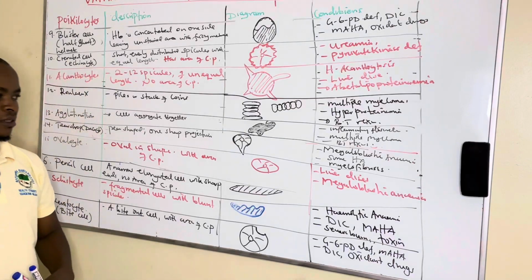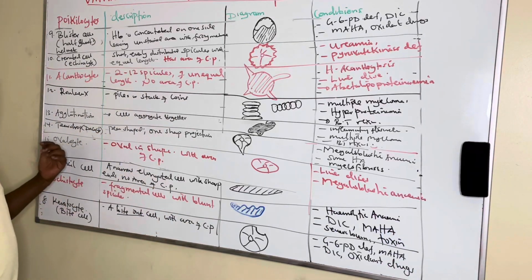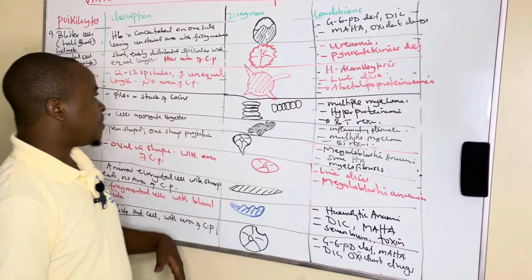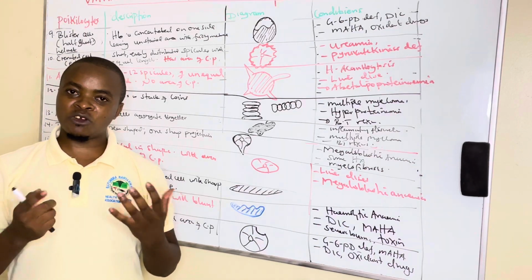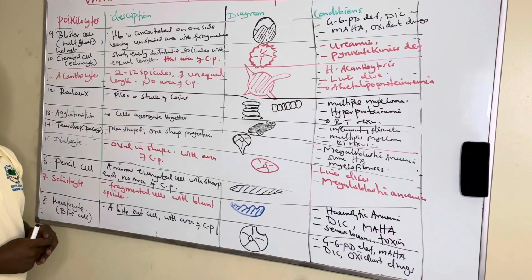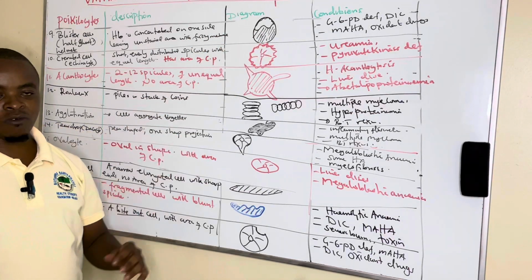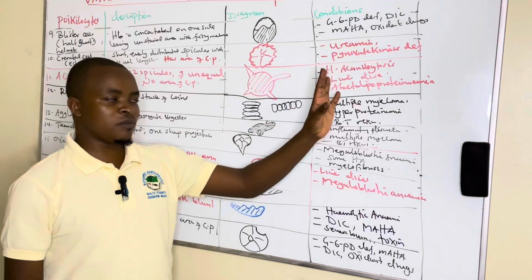So these are the different poikilocytes we have discussed in this video, whereby we have looked at 15 poikilocytes seen under a thin film stained with Romanowsky stains. We have seen sickle cells, which we call drepanocytes, pencil cells, schistocytes, keratocytes, and blister cells which look like half ghosts, where the hemoglobin is on one side. And we have given the poikilocyte description, diagram, and conditions.